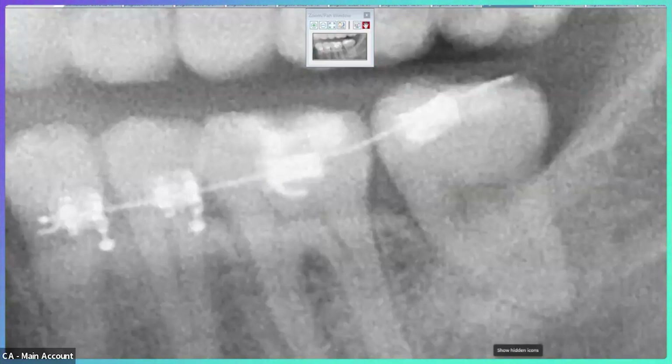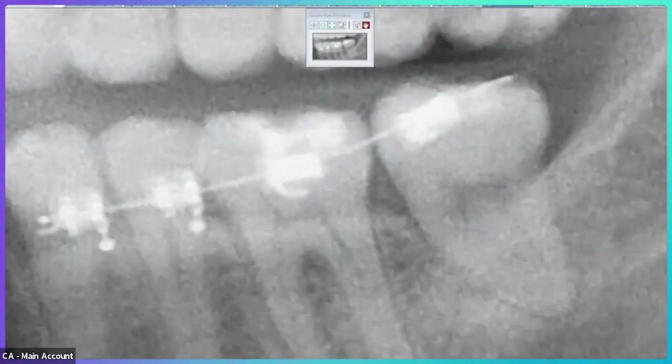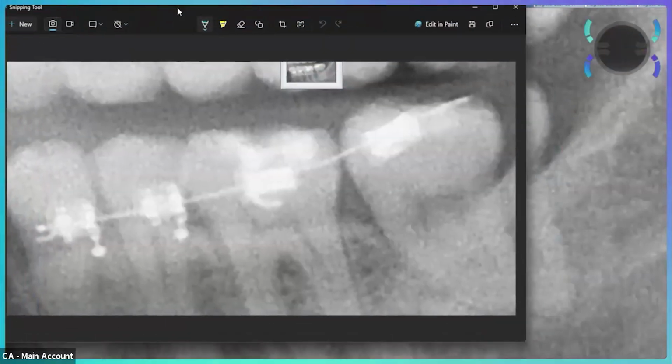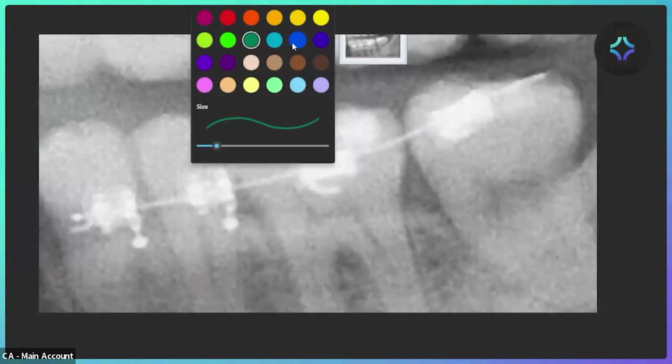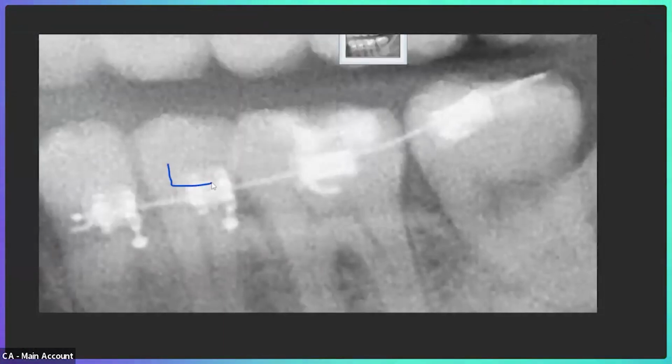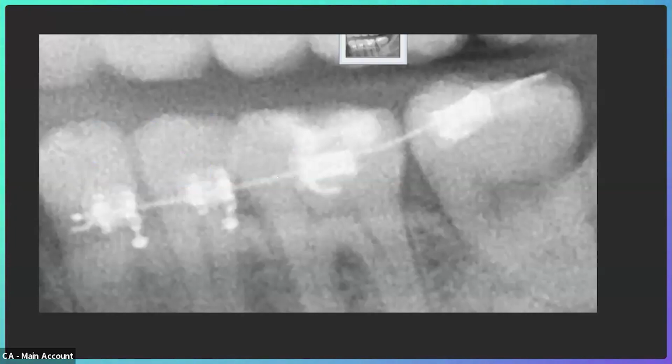But on the second molar, I guess the third molar, what we're going to do is we cheat the bracket position. Normally when you place a bracket, you would place it so that it sits parallel to the occlusal surface, the occlusal aspect. All right, and that's kind of what would go on for these 3, but we did the same thing, just a little bit more gingivally. So pretty much we're parallel here.